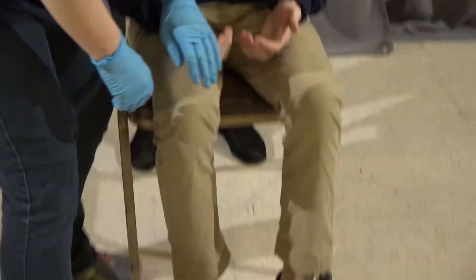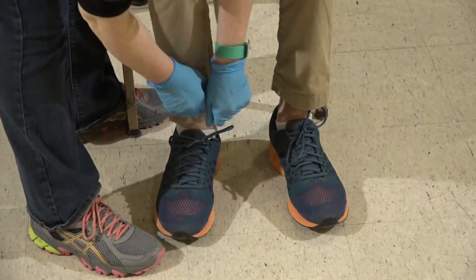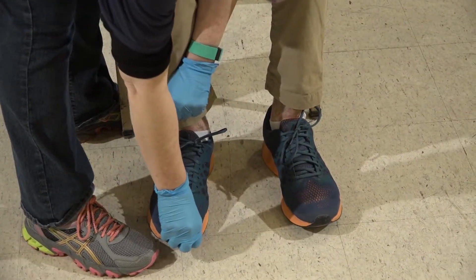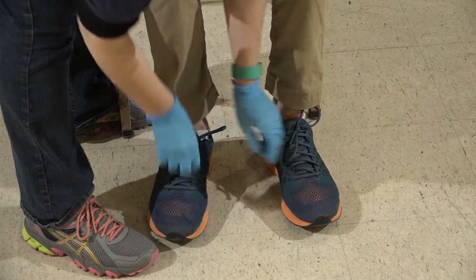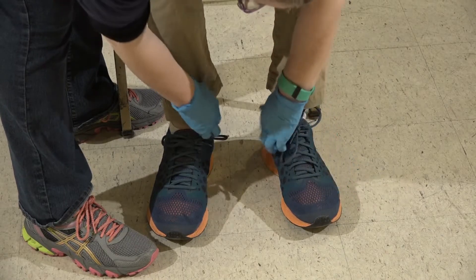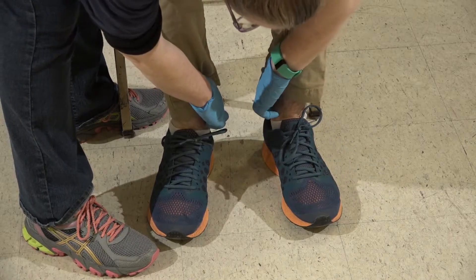Moving to the feet. Wiggle your toes for me. Which toe am I touching? The big toe. Which toe am I touching? The little toe. And I'm feeling for a pulse.